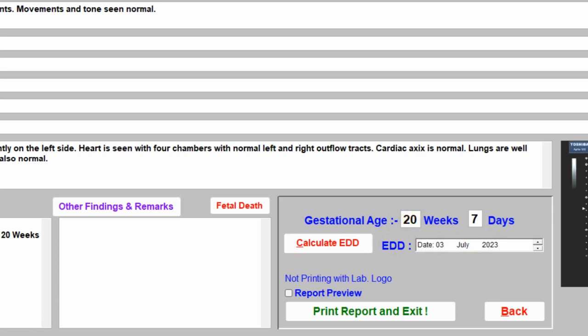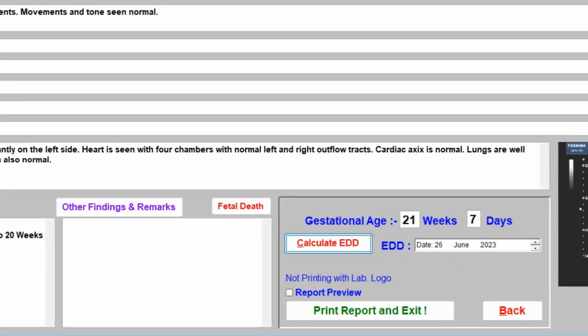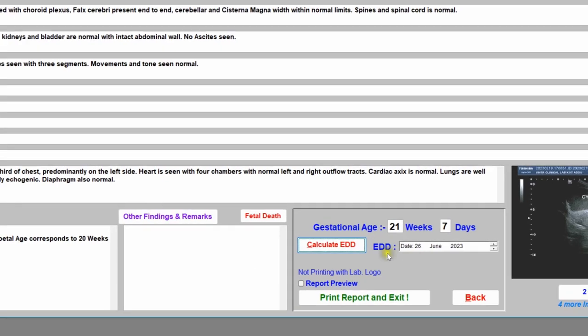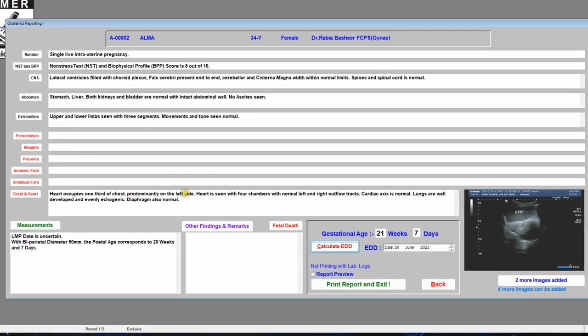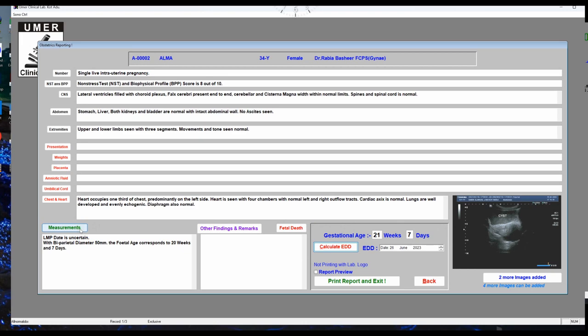If you intend to change the gestational age — suppose you want to change it from 20 weeks 7 days to 21 weeks 7 days — click in that field, change the value, then click 'Calculate EDD According to This Age'. The EDD will be recalculated based on the weeks and days you have entered. Always enter measurements first before editing other fields.